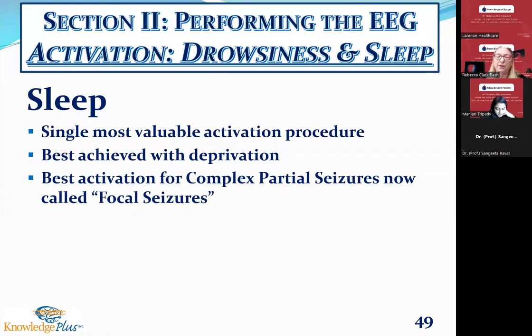This doctor said, we have 70% compliance with our sleep deprivation protocol, which is unheard of. I mean, especially in children, you can't keep them up till 3 a.m. But his diagnostic yield, per John Hughes, was they had 70% efficacy on first EEG with sleep deprivation. And again, we don't sleep deprive our in-house patients, we sleep deprive our outpatients.